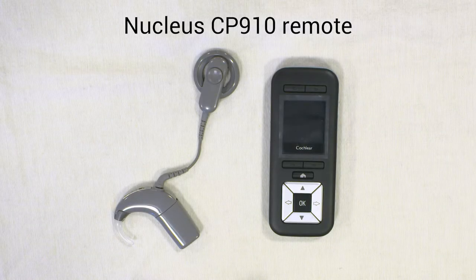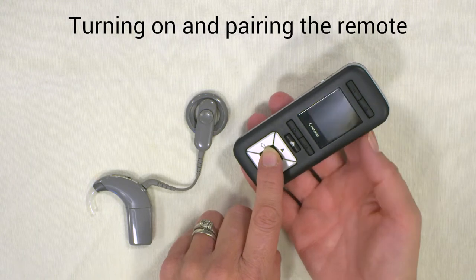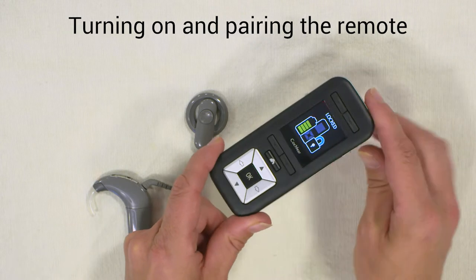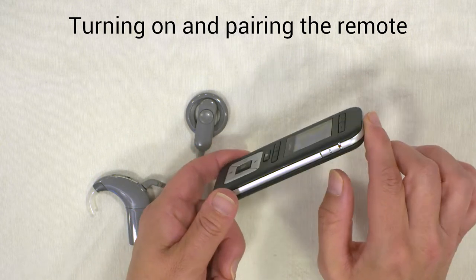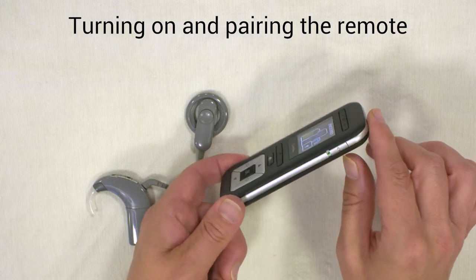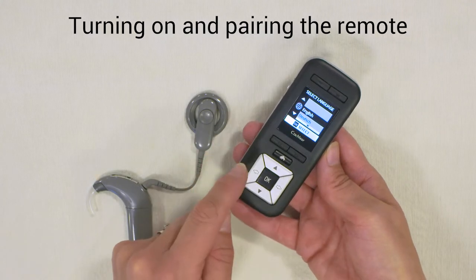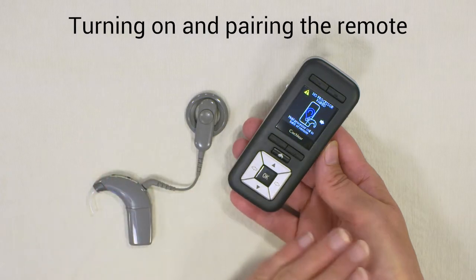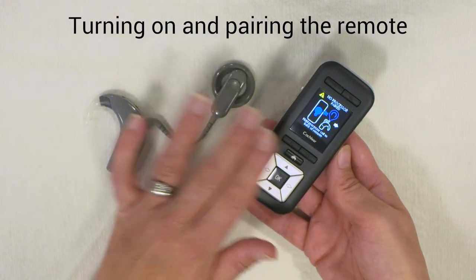The N6 processor comes with a remote, which is useful for changing programs and for troubleshooting the device to see where there's a problem. To switch on the remote, press and hold the OK button and you'll see the Cochlear sign on the screen. There's a lock on the side to prevent buttons being pressed when it's in your bag — you can unlock that by sliding the switch on the side; a little green dot shows it's unlocked. The first time you set up a remote it will ask which language to use. You'll also need to pair the remote with the processor — this is required every time you get a replacement processor or remote.